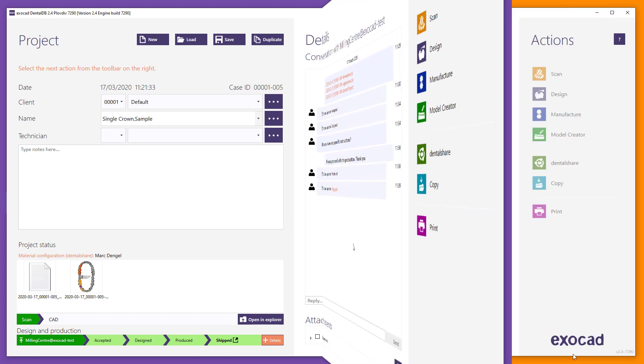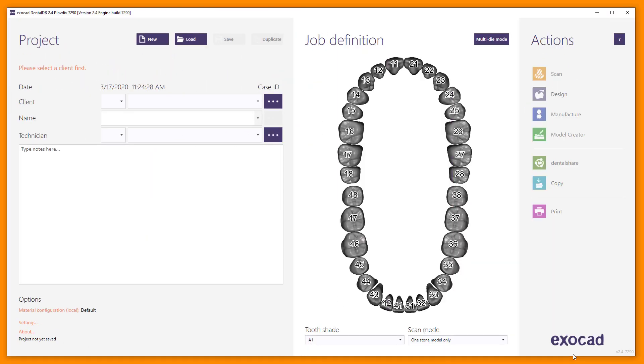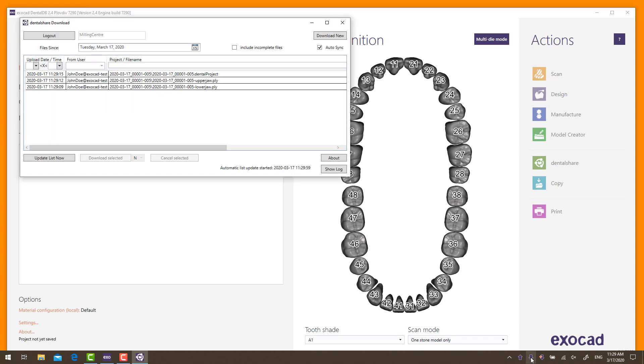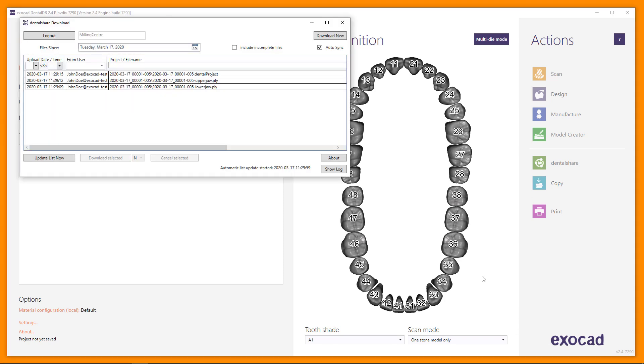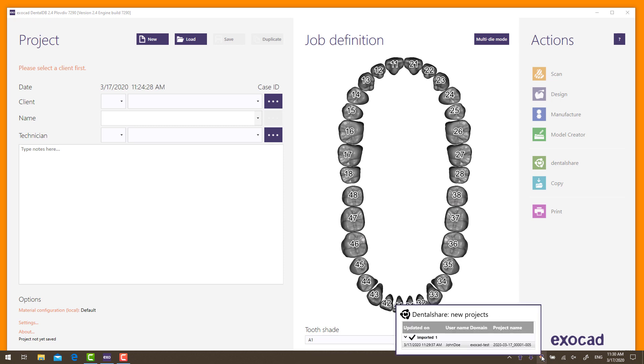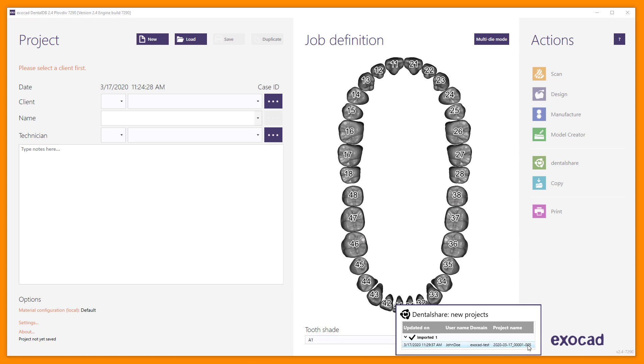Let's have a closer look at DentalShare taskbar icons. By clicking on the Upload or Download arrow, you can view data transfer details in the Transfer Tracking window. The arrow with plus symbol informs of the new projects that have been received. Click for further options. Right-clicking a project in the list opens a menu with available actions. Note, if the recipient receives data while DentalDB is closed, the info arrow will appear the next time you launch DentalDB.